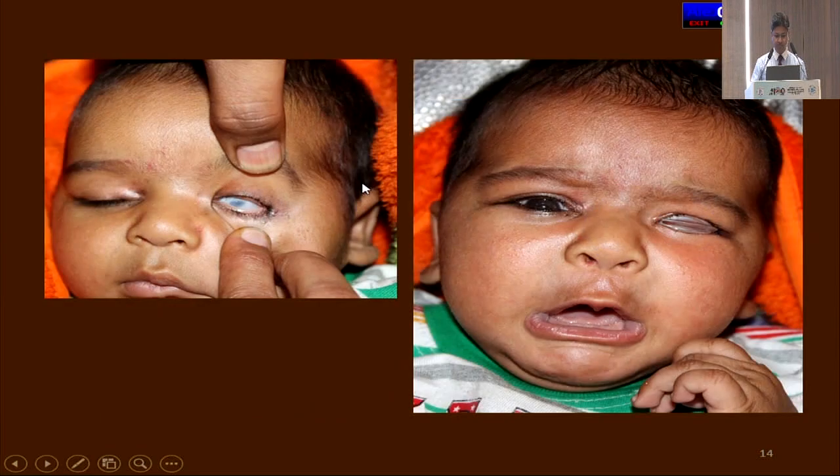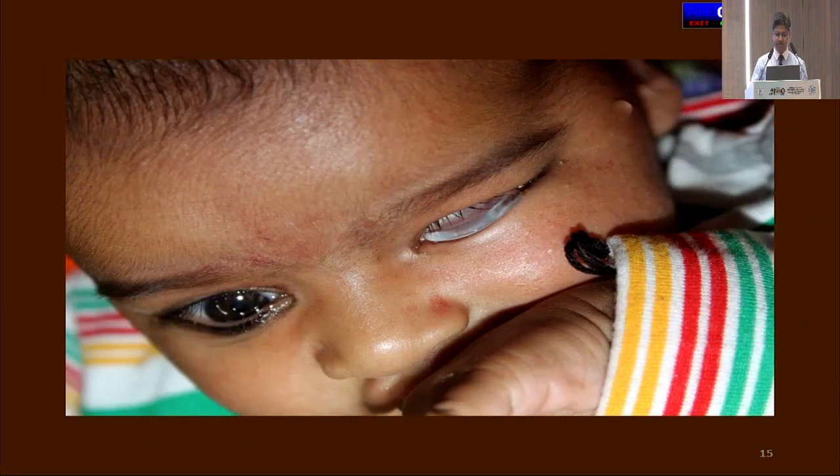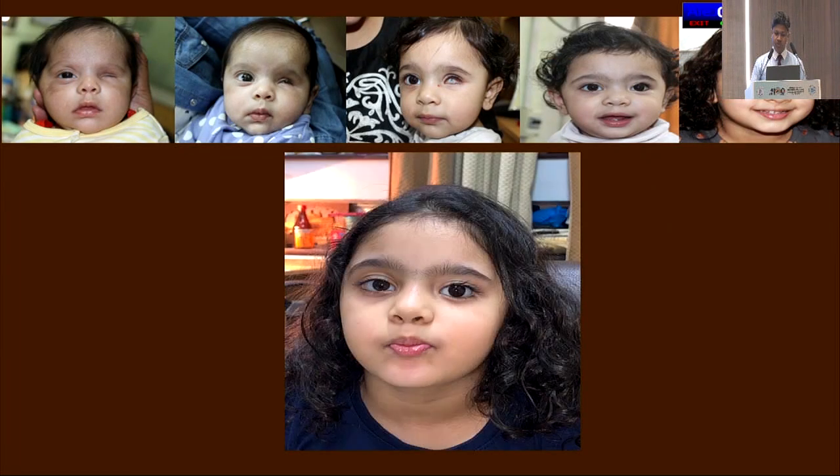So these wedge implants help in preventing rotation, and they also help in horizontal expansion. We have controlled horizontal expansion through this wedge. So this was the case which was treated with the wedge-shaped conformer.